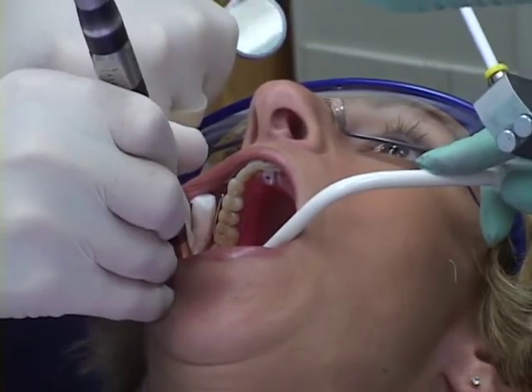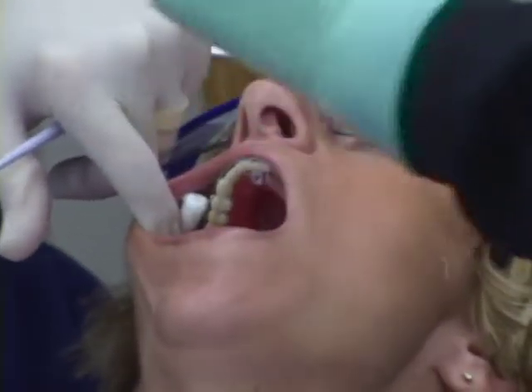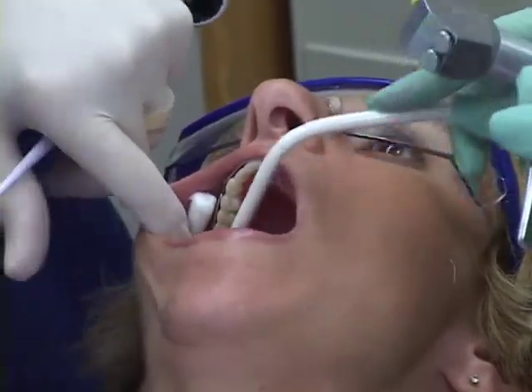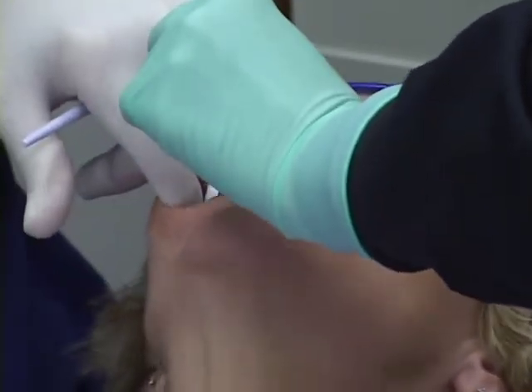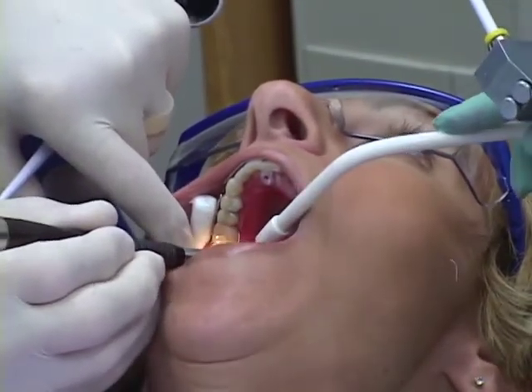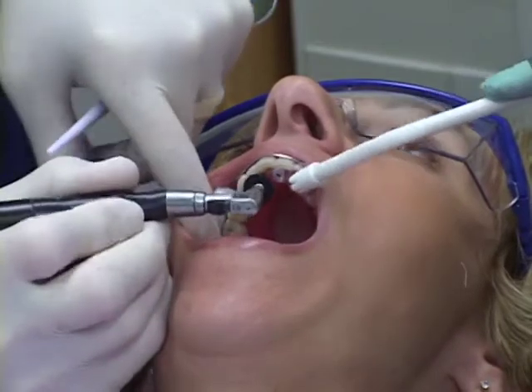As I'm doing my reduction, I am always reducing inclines. It's unusual that I will do any adjustment on a stop or on a cusp tip. Almost all adjusting will be done on inclines. And certainly, all interferences on inclines are eliminated before any stops or any cusp tips are touched. As you can see, we still have maintained a very nice single point of contact on the anterior. I'm going to take that down just a little bit more here.